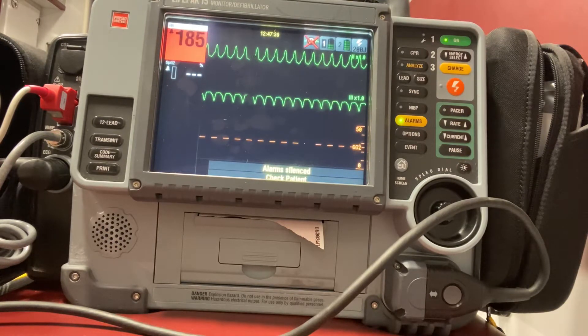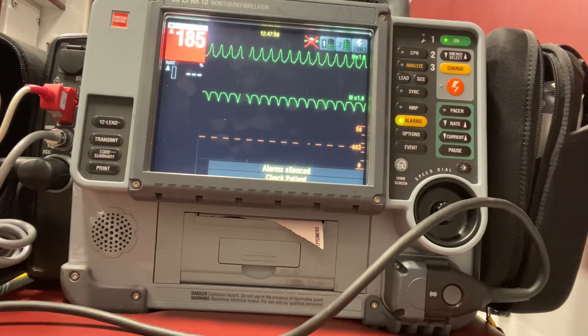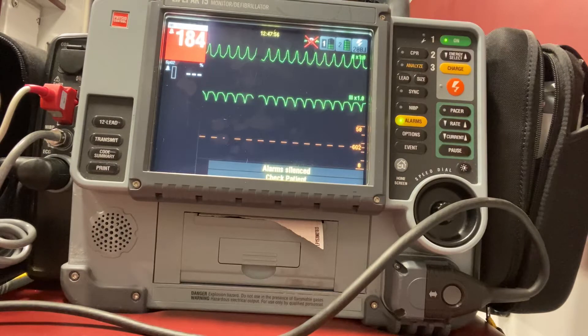It is important that we deliver the shock during the normal depolarization of the ventricles, which would be the R wave. If we were to deliver the shock during the T wave — the repolarization of the ventricles — we could risk having an R-on-T phenomenon, and that could cause our patient to go into VFib.